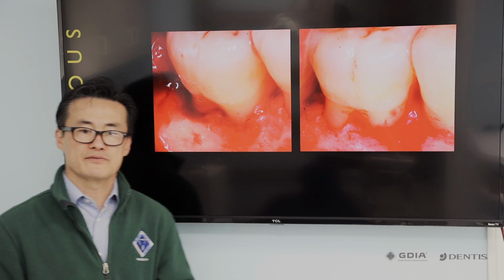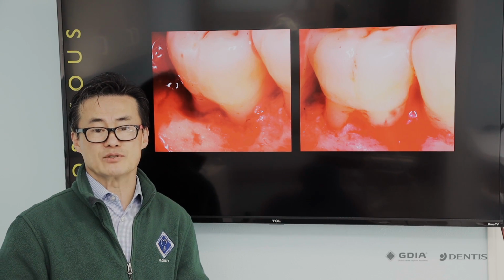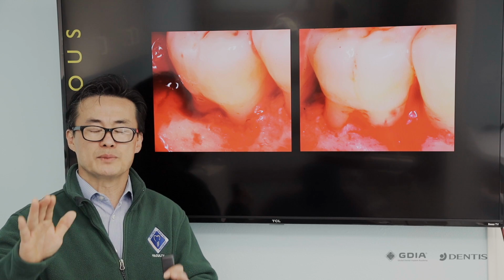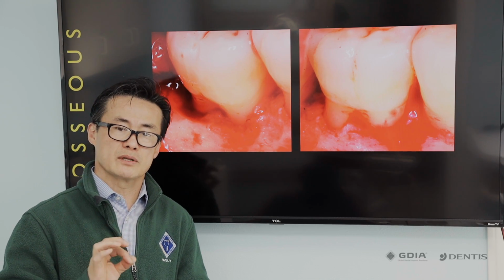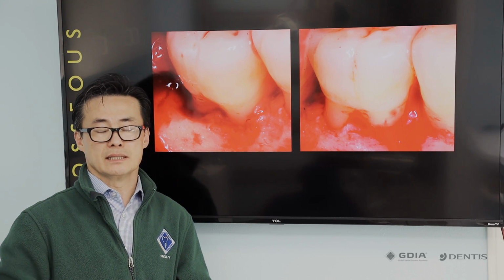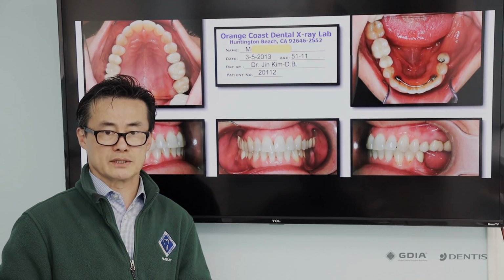Another example is a furcation area. Let's say you're placing an implant right next to this furcation defect. You do want to round off the edges. You want to be able to instrument that, and sometimes rotary burrs have their limits. So piezoelectric surgery tips with aggressively cutting end can actually do a very, very good job in this type of situation.